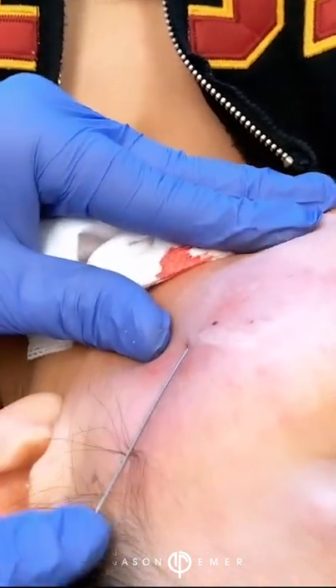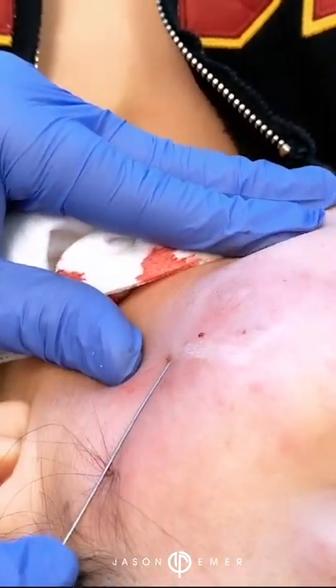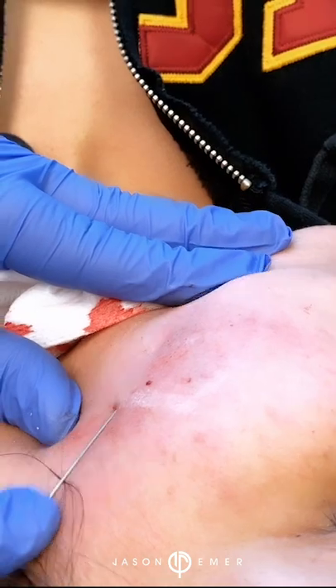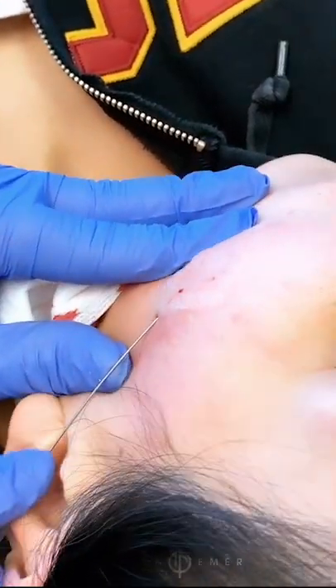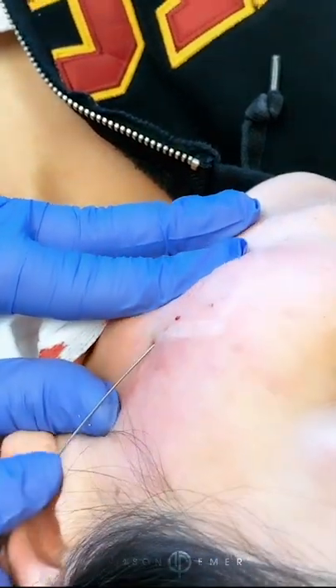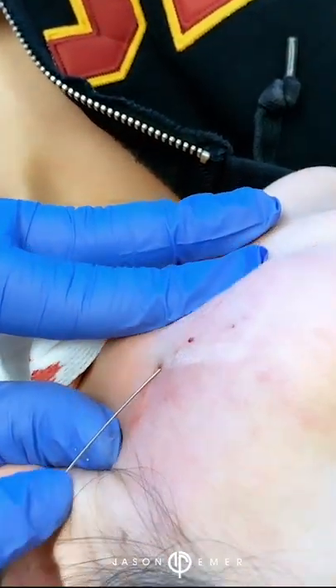The cannula is scraping right there like a shark underwater — it's right there. We're just going to go through the bigger area again, right through that bigger scar. You can see that.